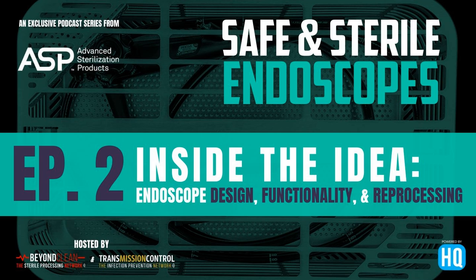I want to go back, Khoi, to something that you mentioned, but also Tamara kind of alluded to it here. In the decision-making process from high-level disinfecting scopes to maybe changing to sterilizing your scopes, one of the most common concerns, maybe not so much from the GI perspective, but it might be there as well, but I know from the sterile processing angle, is the assumption that it's safer for my devices to high-level disinfect them over the long term than it is to sterilize them, even though we all know the margin of safety Tamara was calling out is different for a sterilized device than for a high-level disinfected device. So how do you answer that concern or that question today when folks are like, yeah, but is this the best for my device, the life of the device? Right.